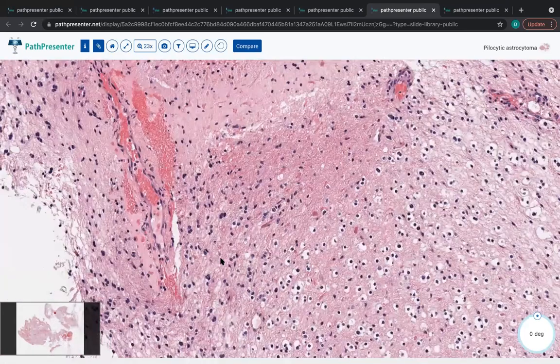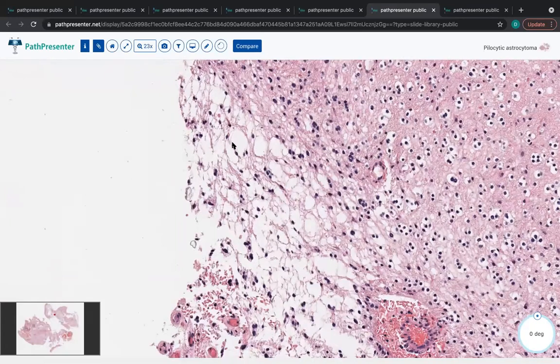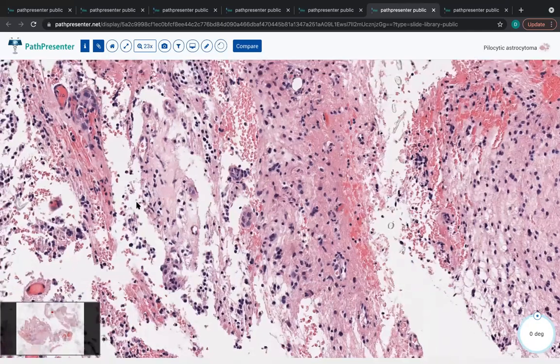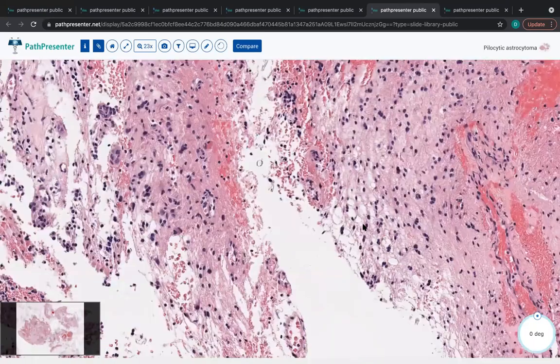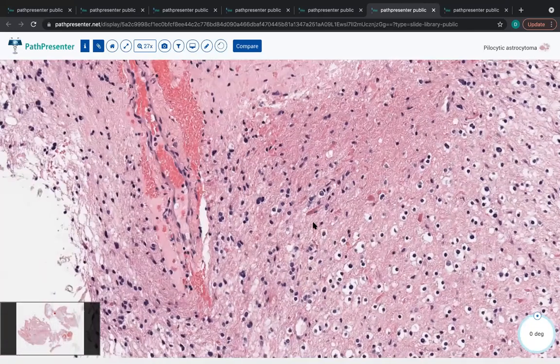Now, at frozen section, many times we'll get these very coarsely fibrillar sections of tumor to examine, and on the smear preparation, they look very characteristic. It's almost like pickup sticks, if anybody is familiar with that children's game, just very coarsely fibrillar processes. Sometimes one can even see the Rosenthal fibers on frozen section as well, and that can be a great clue. Here's a good field, for example. This is not a field you would expect in a conventional oligodendroglioma with these Rosenthal fibers.